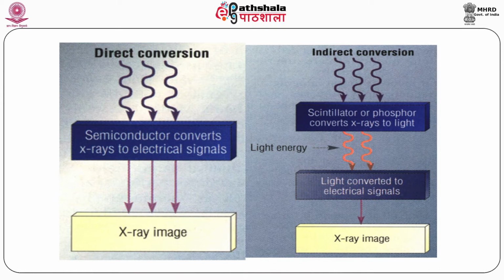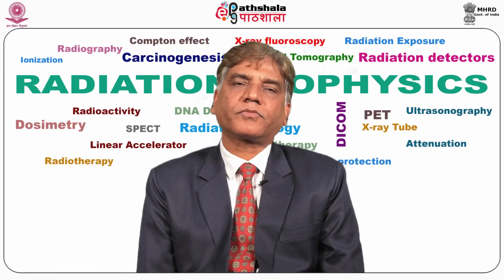The light emitted by exciting the phosphor plate is recorded by the photomultiplier tube in the form of visible image. So, that means the electrical signal is converted into some form of digital signal, and this is how the digital signal is converted back into the grayscale image.